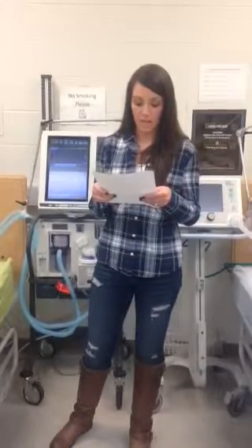By keeping the PEEP at 5, this will allow her alveoli to be stented open, and due to her predisposition of premature airway closure. 30 minutes after each rate change, I will draw an ABG from her ART line to better assess her ventilation and oxygenation. I will correlate the ABG values with her SpO2 and EtCO2. This will assure that our non-invasive measurements correlate with our invasive measurements.